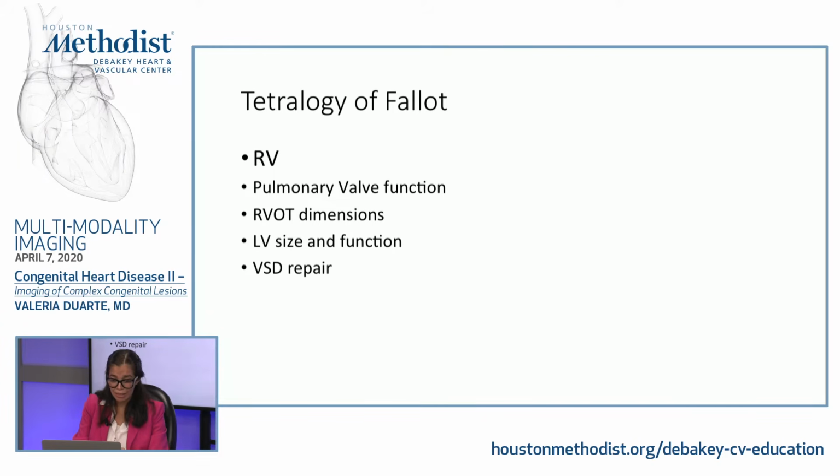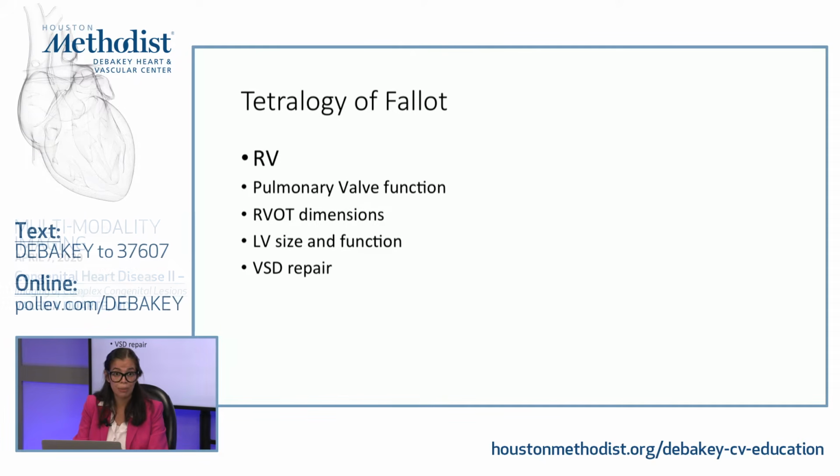In addition, I should mention that we should provide information about the coronary arteries in tetralogy of Fallot, the coronary artery origins, and that's very important because for percutaneous intervention, the coronaries can get compressed. So we can send the patient to the cath lab with our interventionalist knowing whether the coronaries are at risk, right?